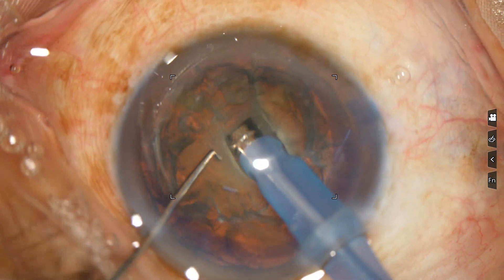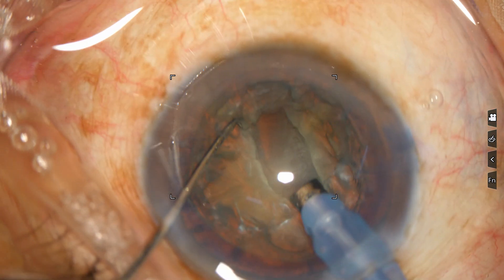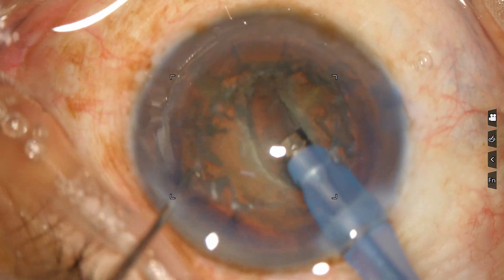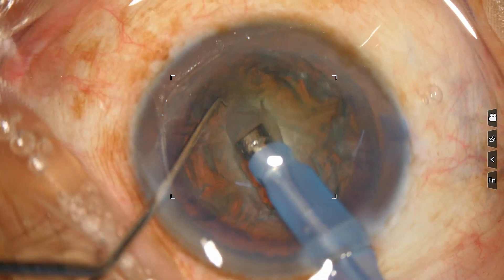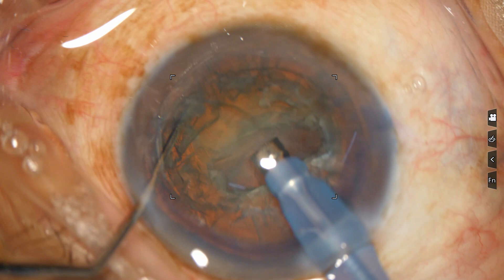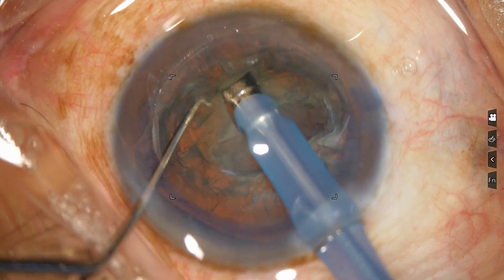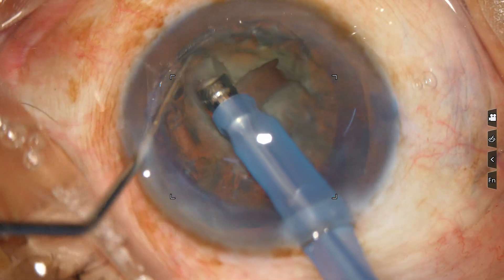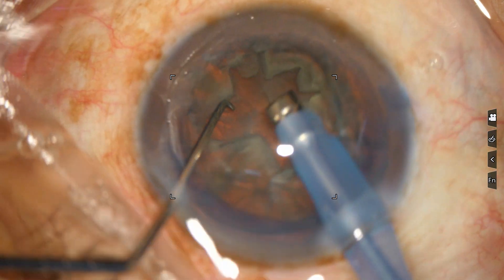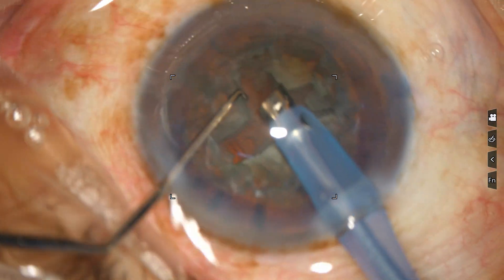You can make the range a little wider. Make it wider. At the central part, go deep. You can make a trench here also. You know it is sufficiently deep — you can see the red glow at the floor. Now let it be irrigation only.